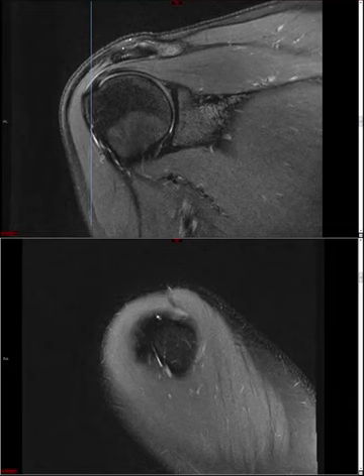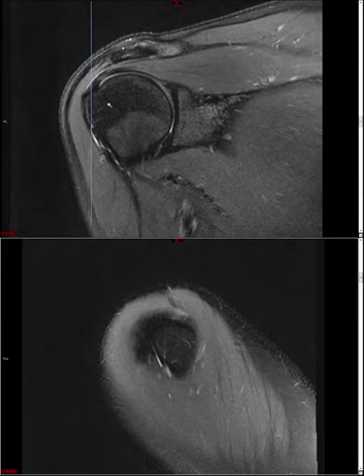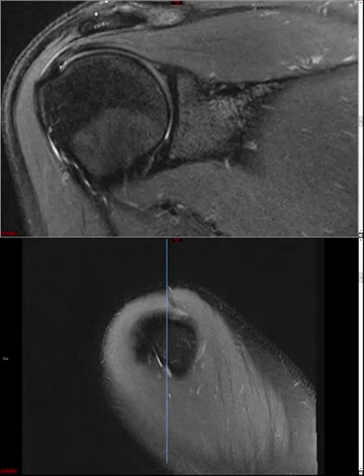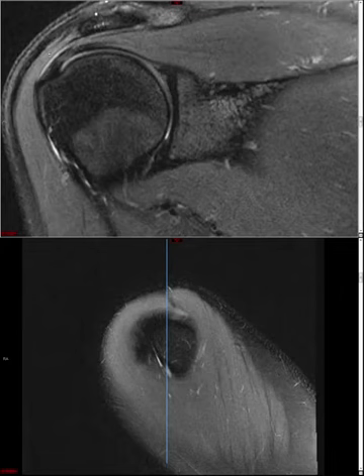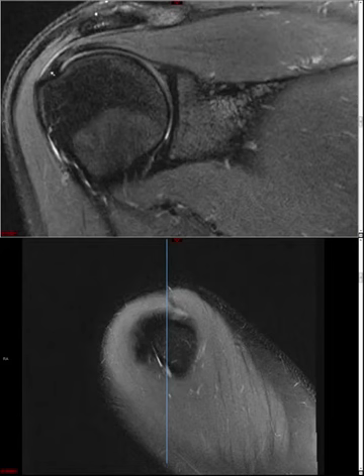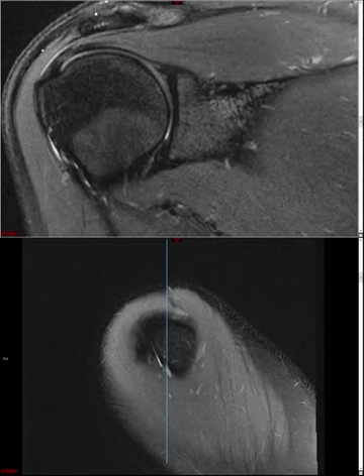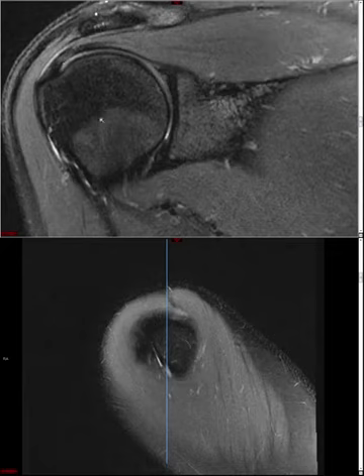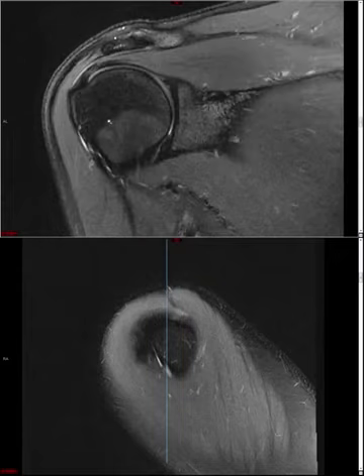If you see all fluid signal in supraspinatus on the sagittal, go to the coronal sequence and ask: at that specific location, what is the status of the articular surface fibers? If they're smooth and intact, you're actually dealing with a high-grade partial thickness bursal surface tear of supraspinatus rather than a full thickness tear. The reason it looks full thickness on the sagittal is that a far lateral image only cuts through the bursal tear and doesn't show the intact articular surface fibers. This is a mistake even fellows make.